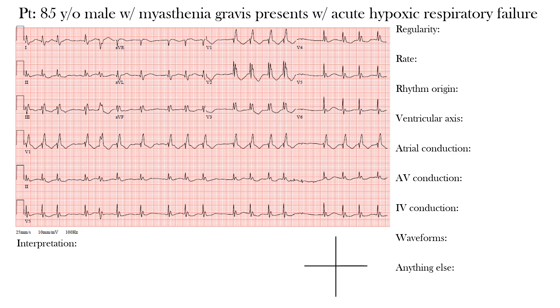Hello, welcome to the EKG Guide and welcome to the EKG of the Week. This week's case is an 85-year-old male with myasthenia gravis that presents with acute hypoxic respiratory failure. His recent EKG is shown here.